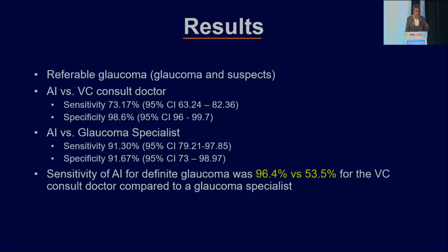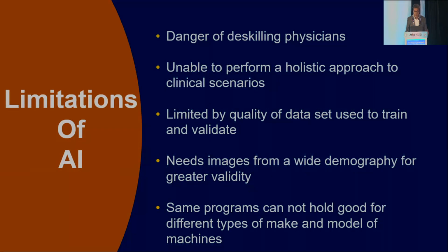So when comparing to somebody doing telemedicine, a junior doctor or a resident doing telemedicine, the AI did a very good job. And more importantly, the AI also helped the telemedicine doctor to learn better. When the AI could detect something, the telemedicine doctor was carefully looking at it and saying, oh, I missed this defect, oh, I missed this change, or the subtle notch which the AI was able to pick up.